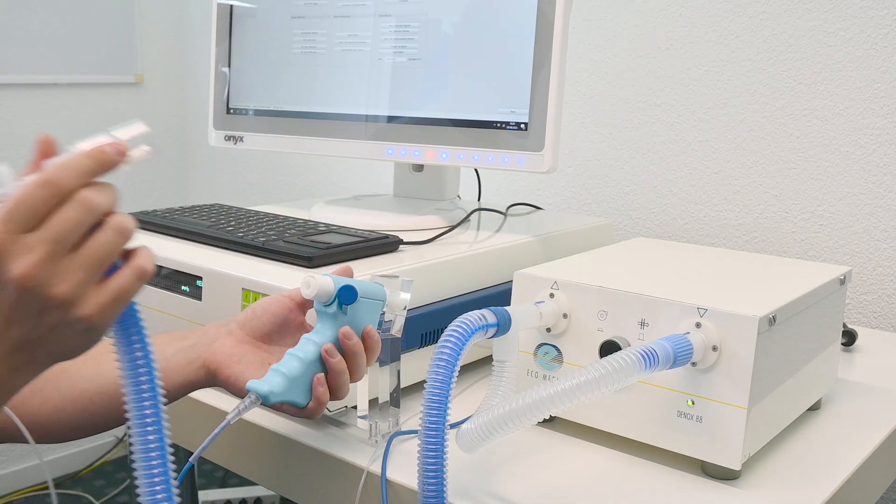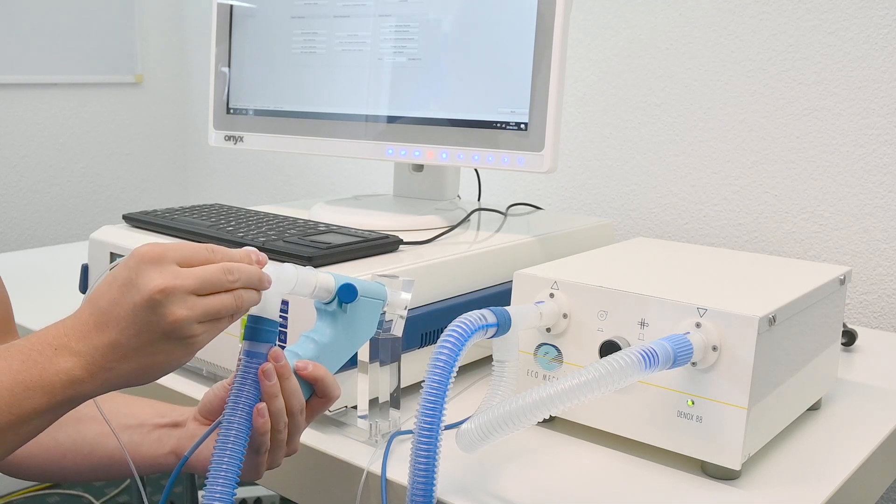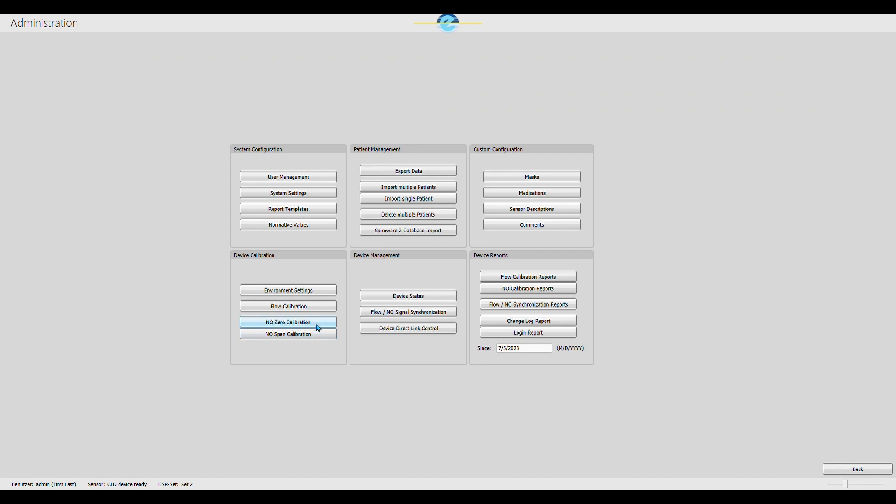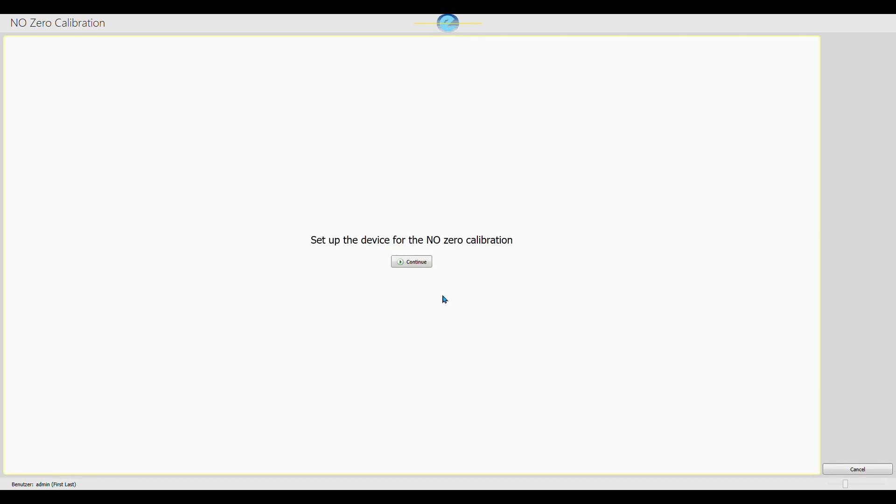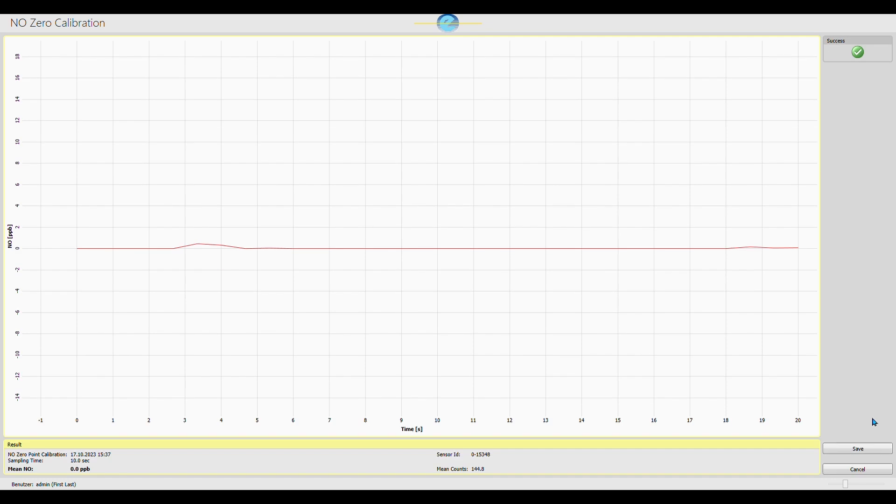Attach the measurement set and sample tube to the flow head. Then, open the Administration menu in SpiroWare software and start the NO0 calibration. The calibration takes approximately 20 seconds and successful completion is shown by a green check mark. Save the calibration and close the calibration window.